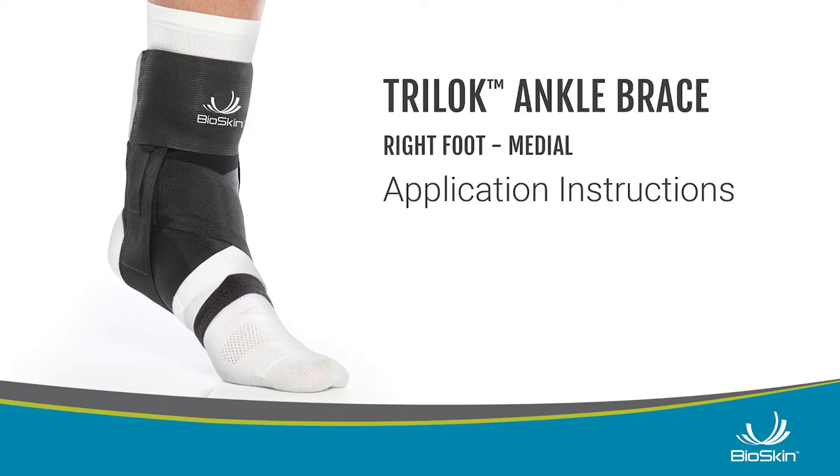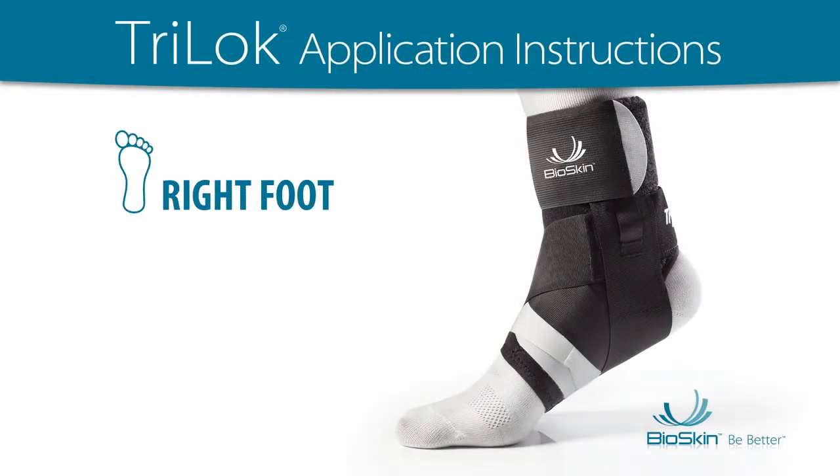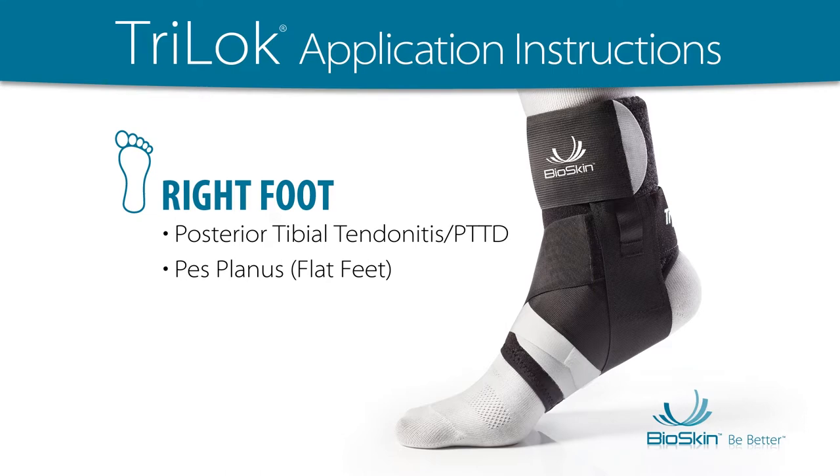Tri-Lock application instructions: right foot application for posterior tibial tendonitis, pes planus, flat feet, plantar fasciitis, or heel pain.